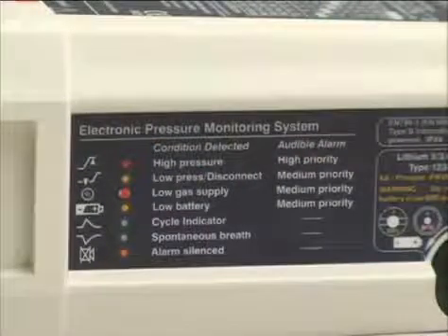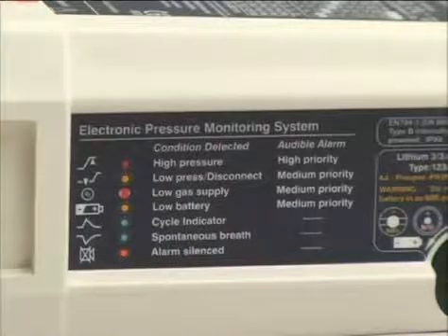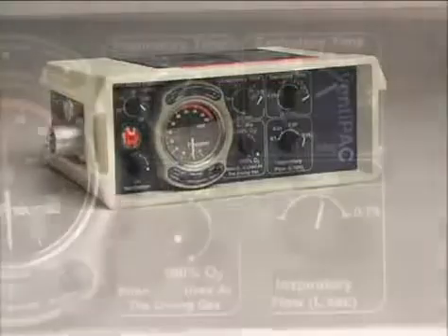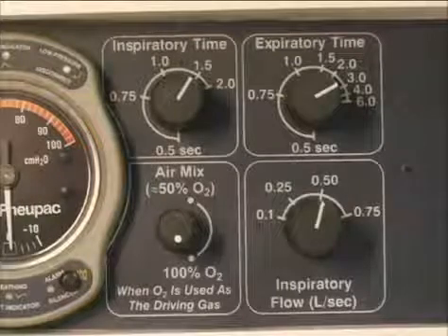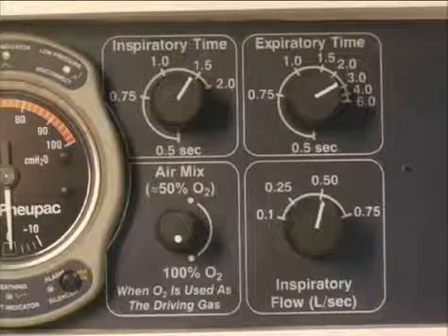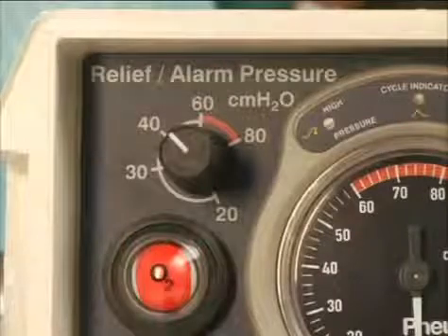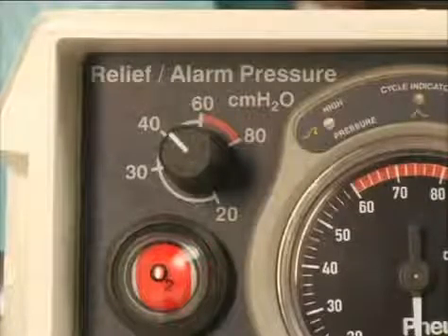For any concerns or questions regarding the meaning of any alarm, refer to the diagram located on the battery side of the ventilator. The information that follows details procedures you will need to learn in order to operate the ventiPAC ventilator successfully. Set the ventilator inspiratory time at 1.5 seconds, expiratory time at 3 seconds, inspiratory flow at 0.5 liters per second, the air mix switch set to 100%, and relief pressure at 40 centimeters of water pressure. By leaving the unit at these settings, it will be fully functional with a minimal amount of readjustment.